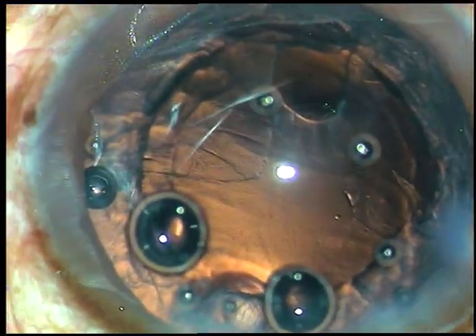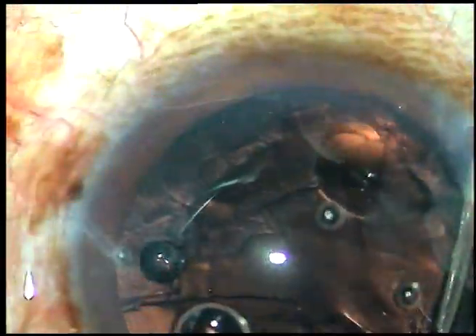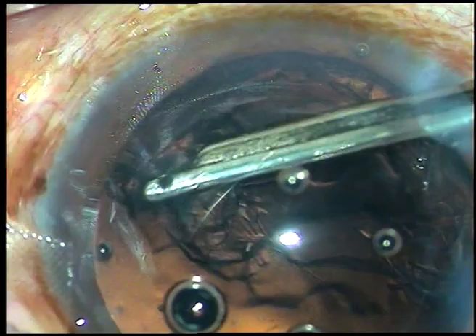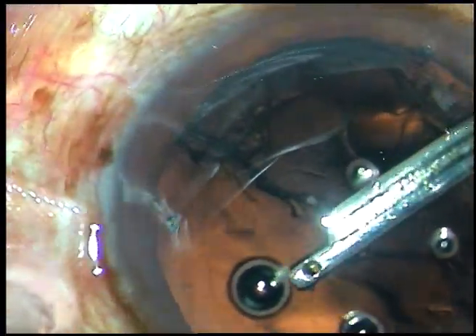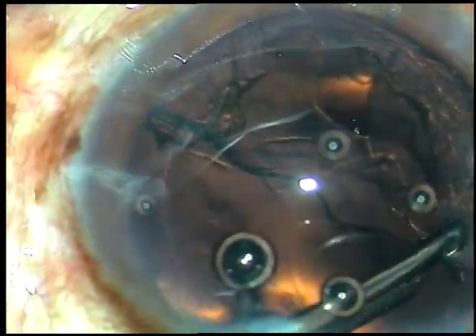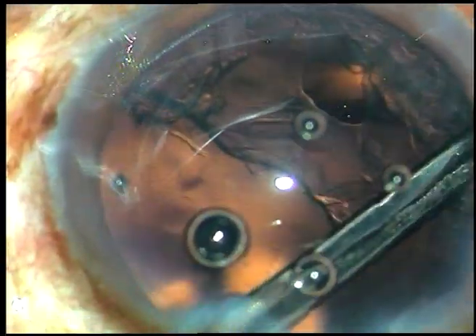Now I am going to use a Simcoe cannula to remove the cortical matter from the area which is away from the rent — that is from 12 o'clock. Then I go on either side. The viscoat is nice in the sense that it keeps the rent plugged very nicely, and we can work around it quite confidently.